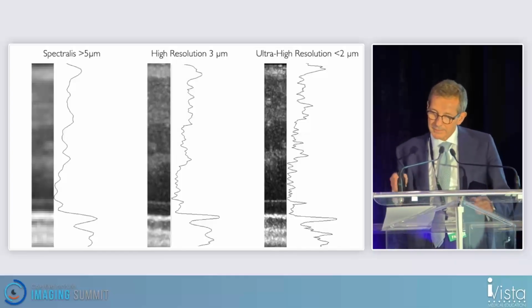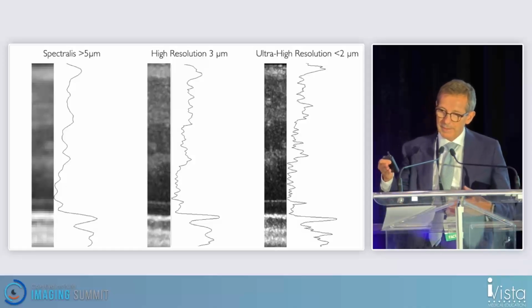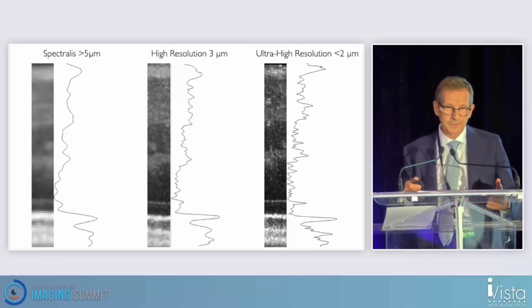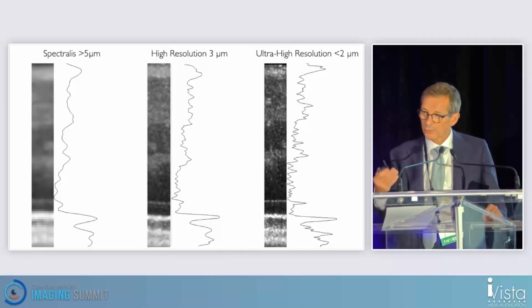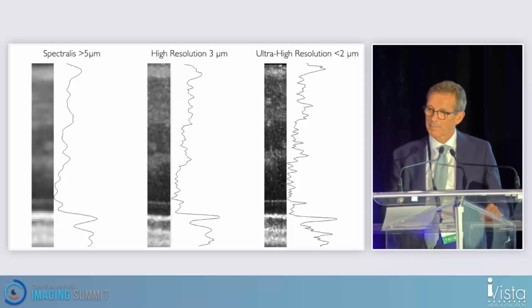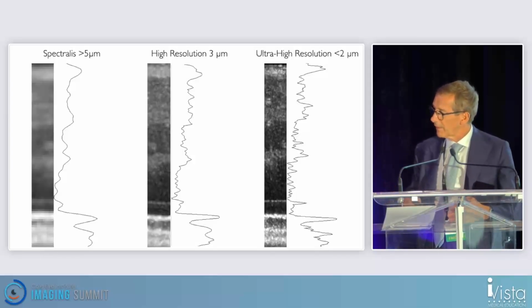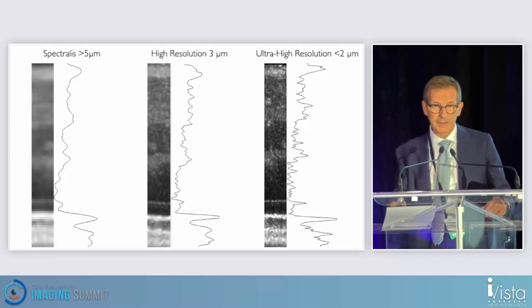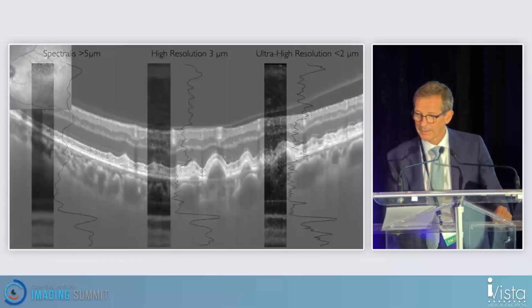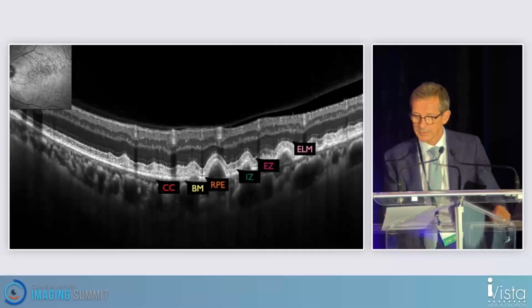The ultra-high resolution is similar to the visible light OCTs that go to 1 micron, and that is probably important not for the eye by itself, but for oculomics, looking at systemic disease through the retina. Here is one example image, and you can see all the layers.